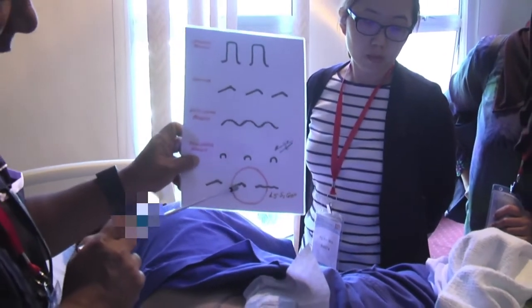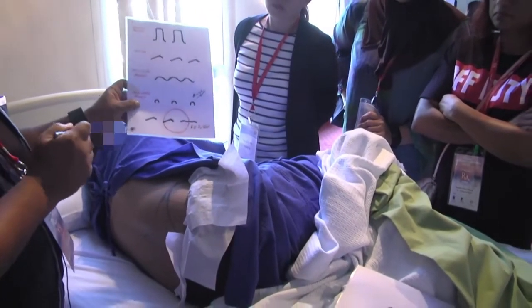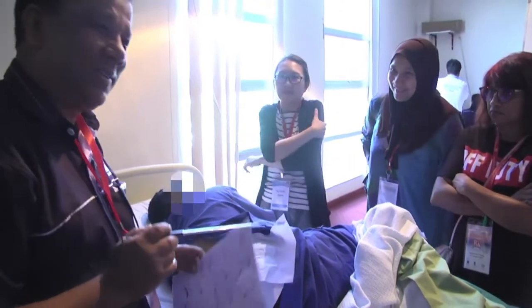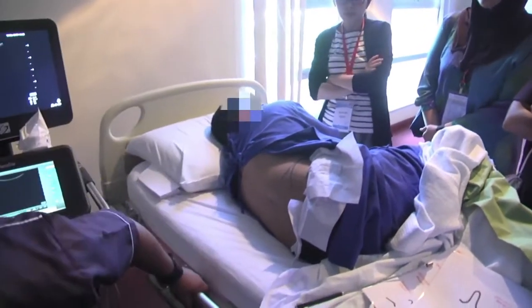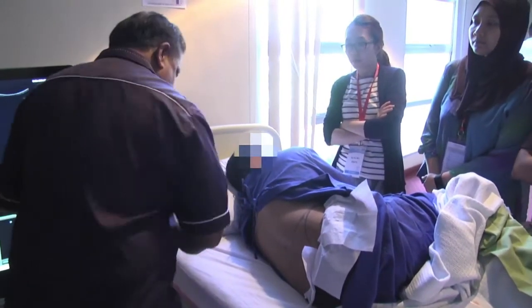Once you find L5, you can move the probe cranially. You'll find L5, L4, L3, L2, L1, whatever, okay? You don't want to go that high. L3, L4, L5 is good. Okay, so let's do the scan and have a look and see what you can do. Then we divide ourselves into two groups, and then you can have a little hands-on.